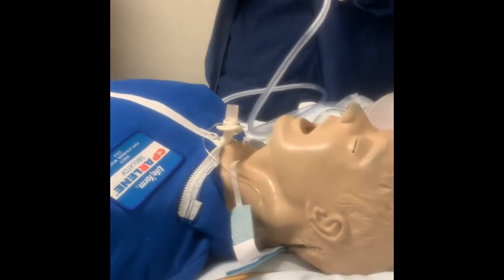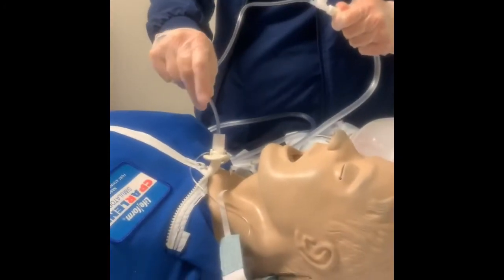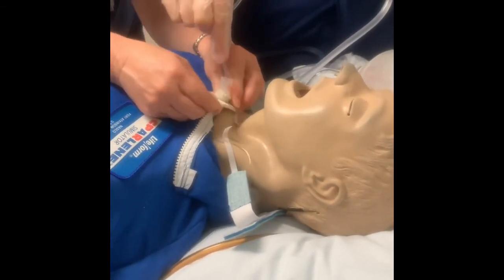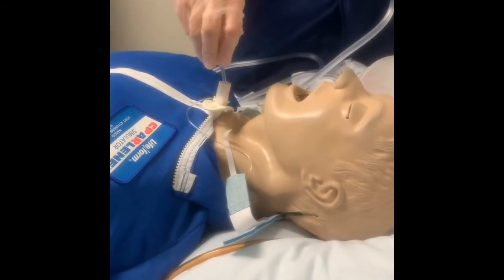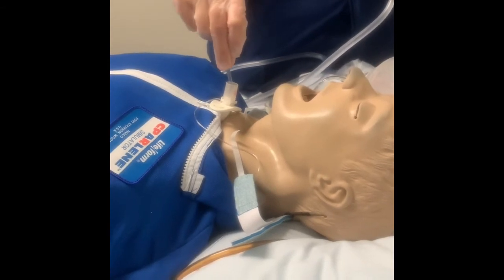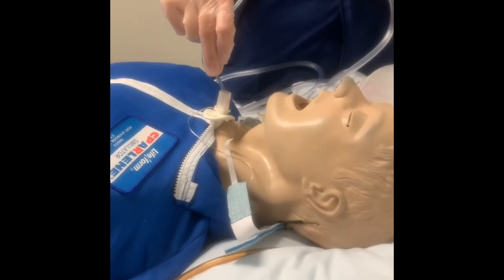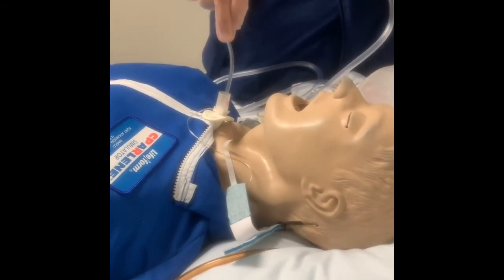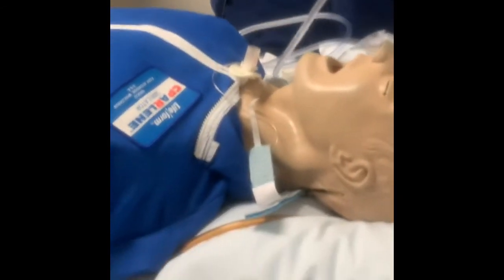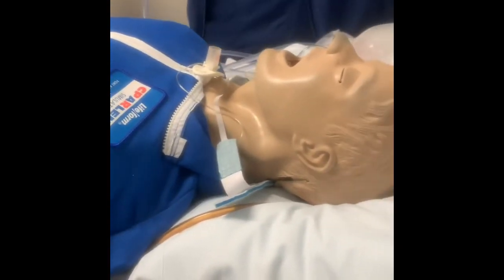So don't apply suction. Insert till I meet resistance. Correct. And this one's going to be real shallow. Do you feel it? And then come out, pull it back a smidgen, and then do suction and swirl it out. For how long? No more than 15 seconds. Then I would just clear the line with saline and go again, as many times as they need it.